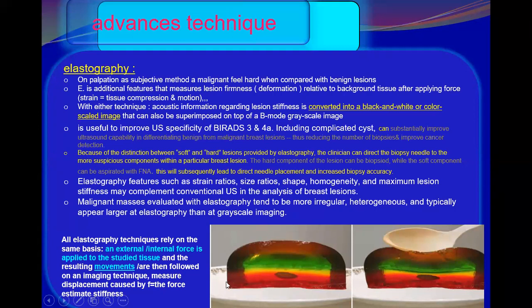You see, if you imagine this is the breast and here the lesion, by applying force here, the tissue will definitely move, the breast tissue as well as the lesion inside the breast tissue.